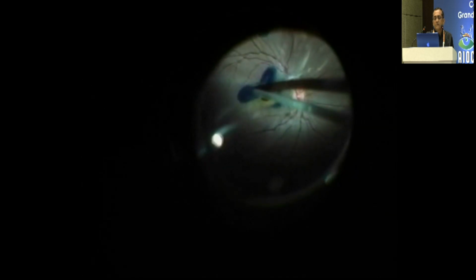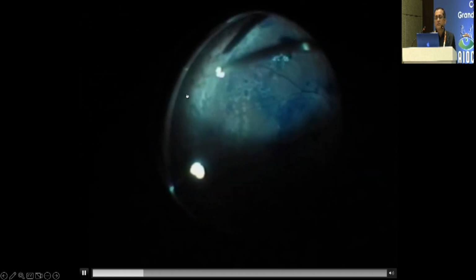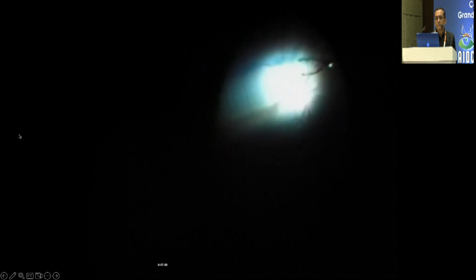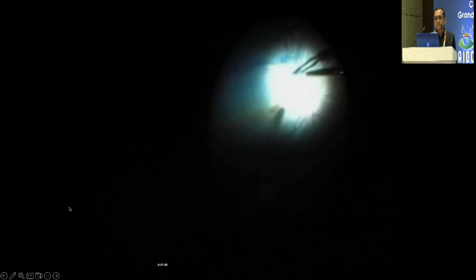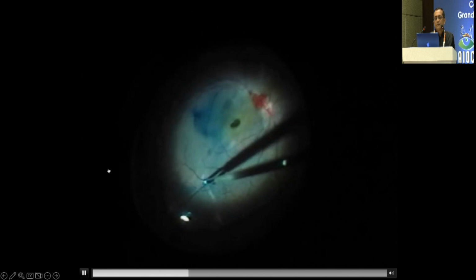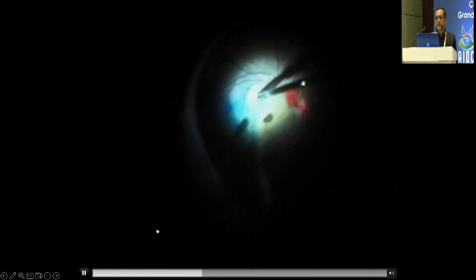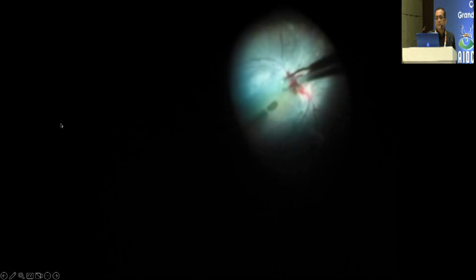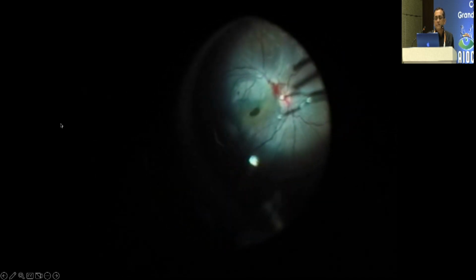The age of the child was 9 years old, and she is a one-eyed child. She was operated for a giant retinal tear. We can see the laser marks there, and it's a pretty big size hole. But the posterior pole was a little bit boggy, and we can see the attachment is also quite tenacious, unlike the normal ILM.